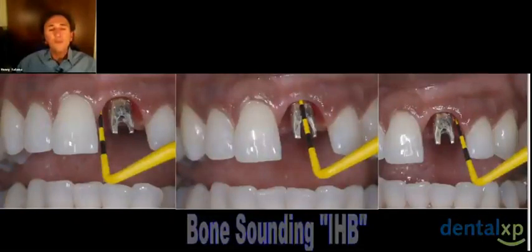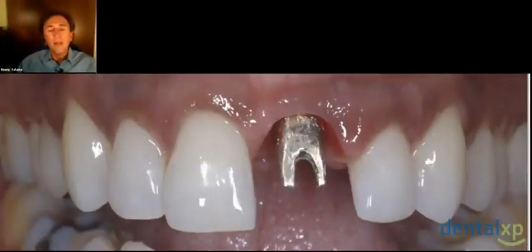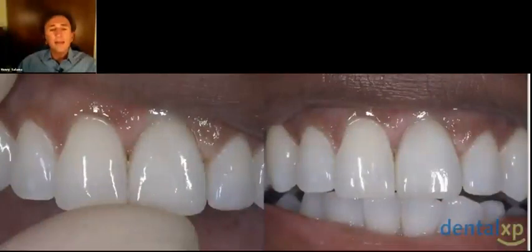Because the tissue is more than 2 millimeters thick in this area, we're using a standard metal abutment. At this point in time, we can add contour to literally push the soft tissue more apical. You'll see a little blanching in this area as we've added contour to the final crown because it's more contoured than the temporary.